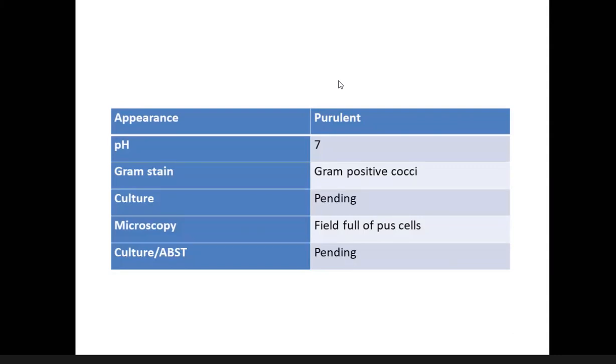For the complete diagnosis, you have to look at the case scenario as well. The patient presented with cough, fever and difficulty in breathing, and when you do the chest X-ray, there is evidence of right-sided pleural effusion. So the most likely complete diagnosis is right lower lobe pneumonia leading to parapneumonic effusion, isn't it? You have to take the history as well.